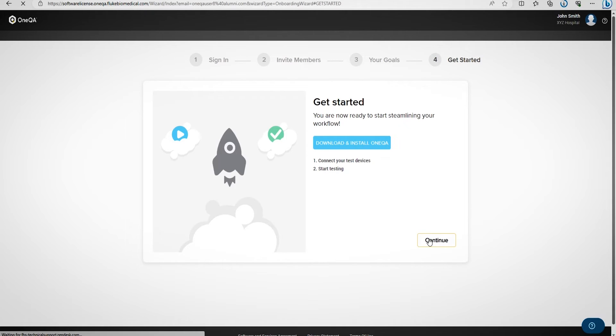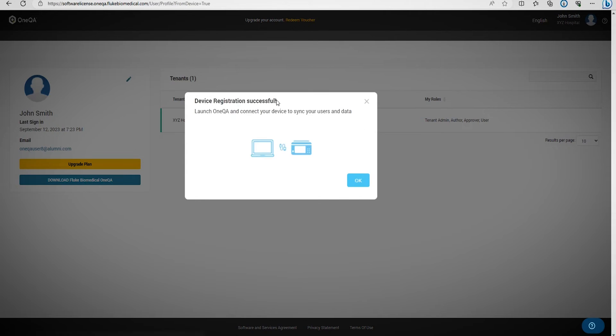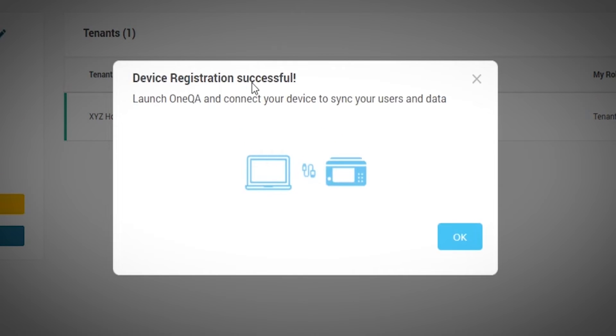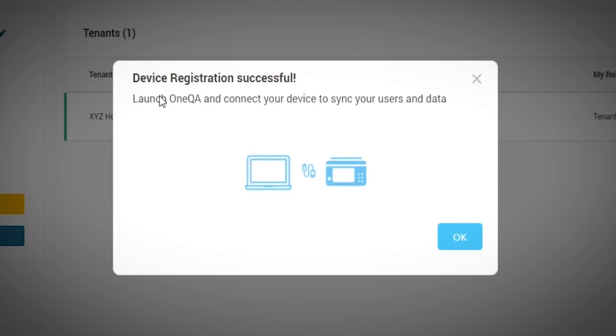Then select Continue. Your device is now registered, and you have successfully created a OneQA account. You can launch OneQA through the downloaded software. Click OK.